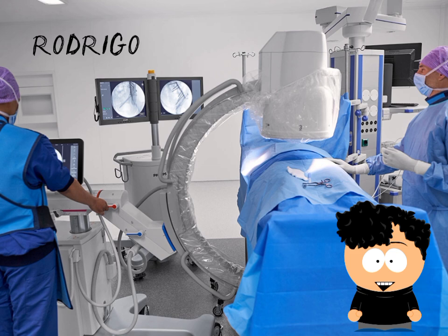The X-ray generator produces the X-rays used to obtain images. The X-ray tube emits X-rays towards the patient. The X-ray detector captures X-rays that pass through the patient's body and converts them into electrical signals. The C-shaped design allows for greater flexibility and access to the patient during procedures.